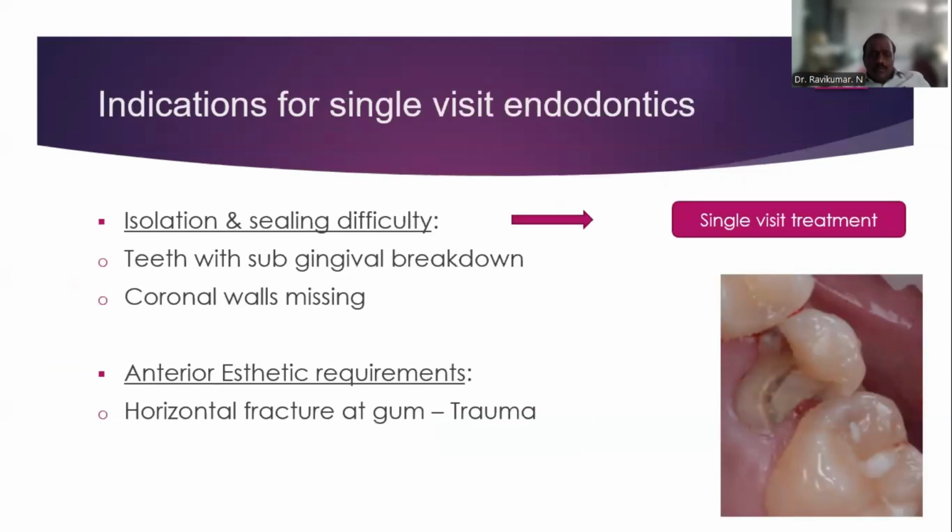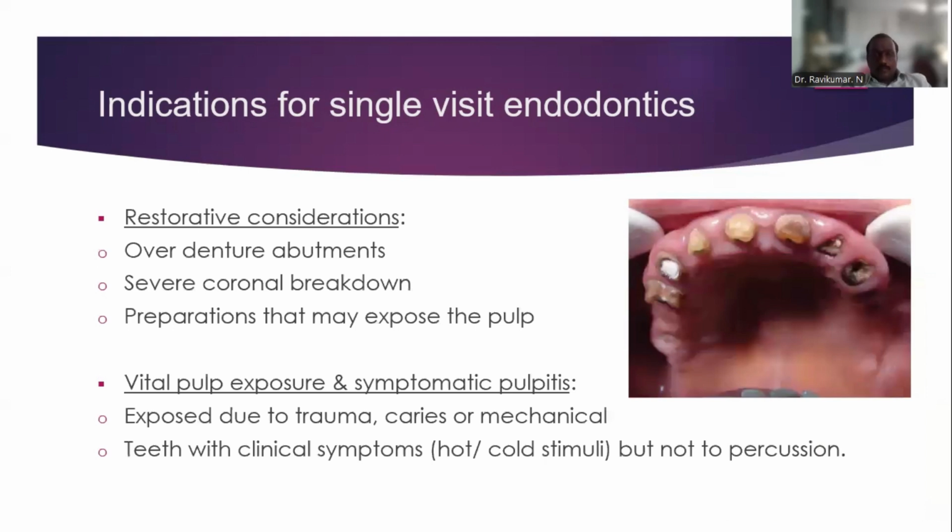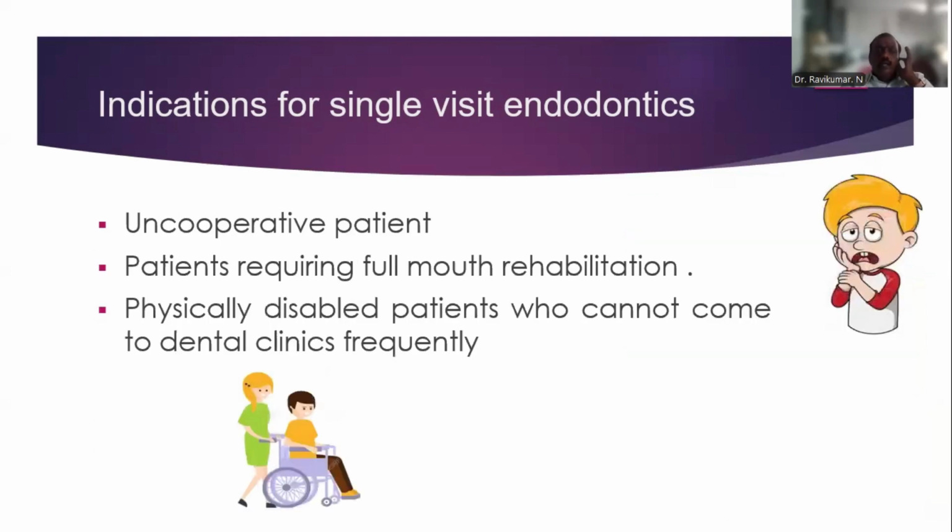Further, we have to properly isolate and seal. Then, if really needed, we have to think about any aesthetic restoration, or if needed, we can give a crown for the patient. We take an impression in the same visit, recall the patient after a week, and give the crown.